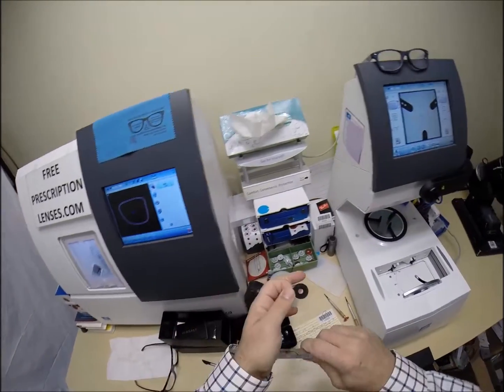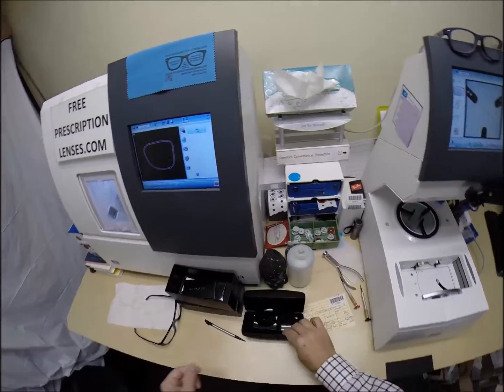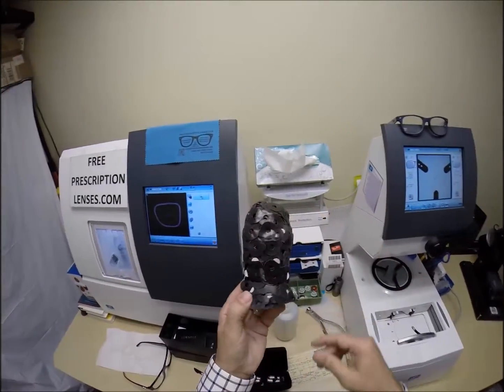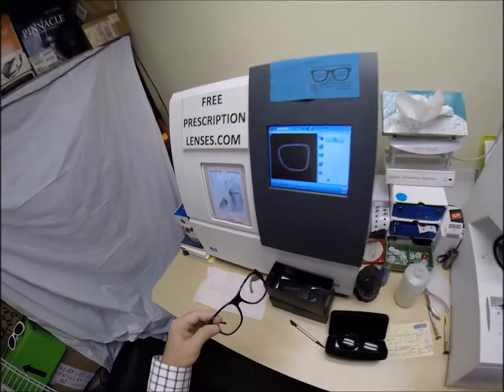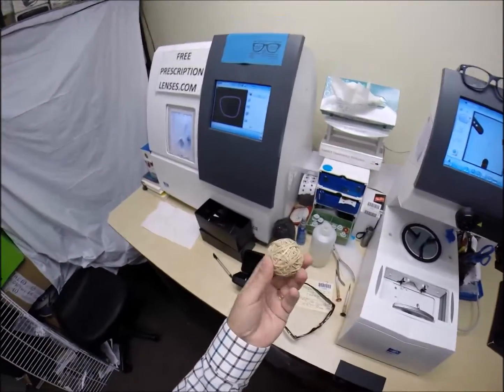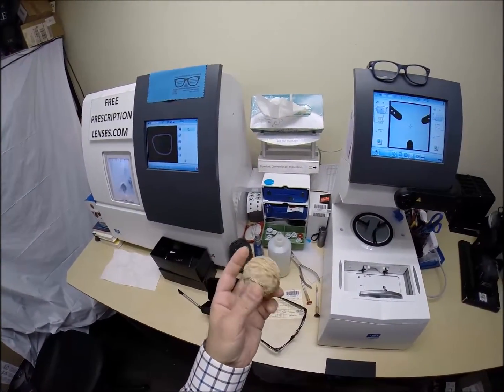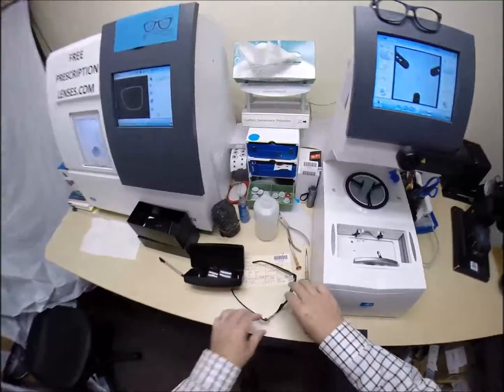Take that block off, dry that off, add the sticker to my collection there. It's getting bigger. It takes a while. You know, the other nice thing is all the rubber bands I get that come with the lenses wrapped up, and saving those and making a ball out of that, so you can watch as this grows too. Let me set that down over there.